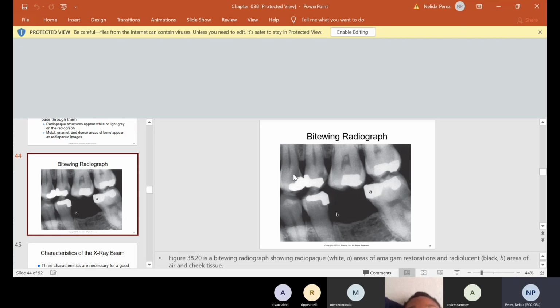Now, we are going to discuss a little bit later on more of the different parts of these, what you can see on the teeth. But real quick, because this is a really good x-ray to show you a couple of things. Here are the nerves in your premolars, and then back here are your molars. You can tell the difference between your molars and premolars. Now you can see these are the molars, and these are the premolars.